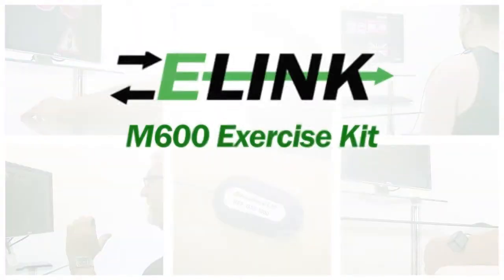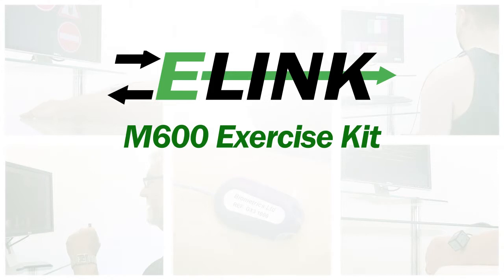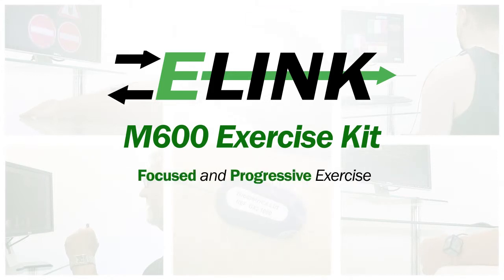The e-Link M600 exercise kit. The ideal solution for focused and progressive exercise.